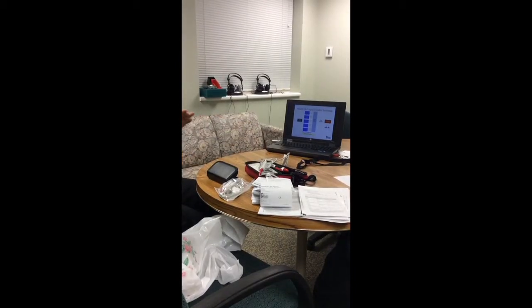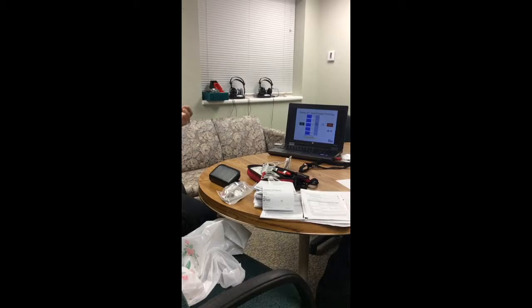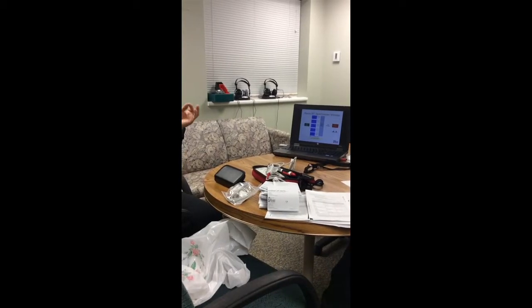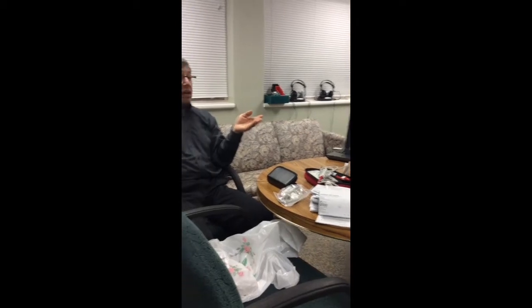Now, where inaccuracies make the most difference is at our NICU units. First of all, we know in a NICU unit we have to titrate oxygen very carefully, or we have the potential for retinopathy. The other thing is, and if you've worked in a NICU unit or in an area where you've got little kids flailing all day long, what do the monitors do?